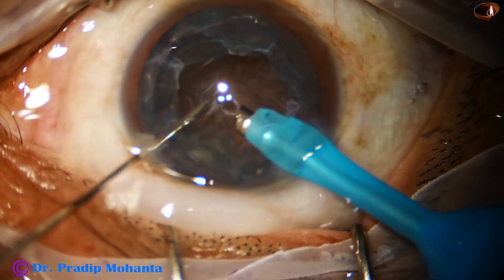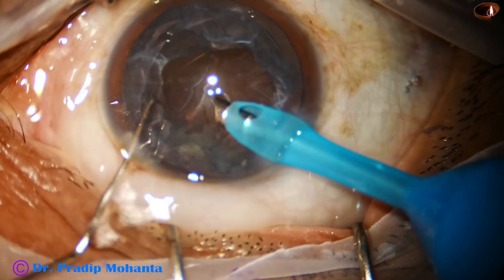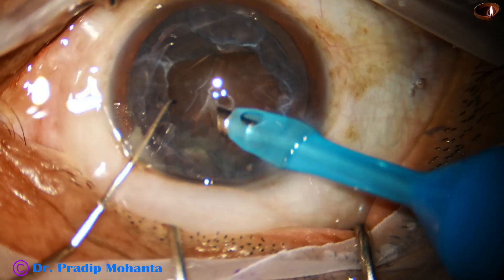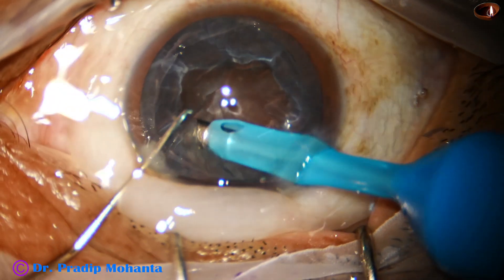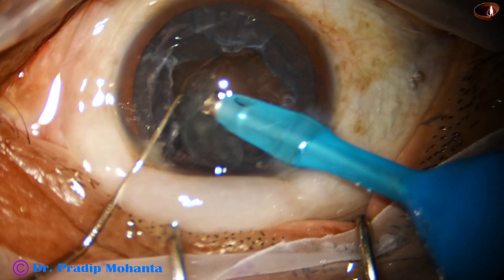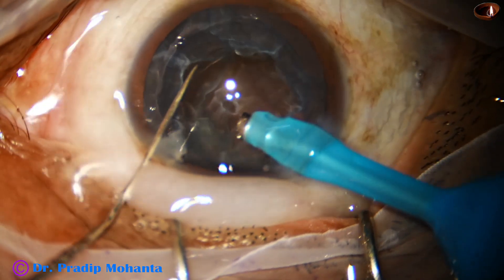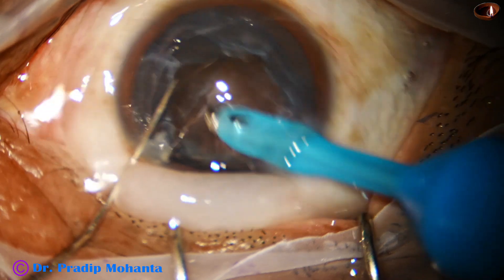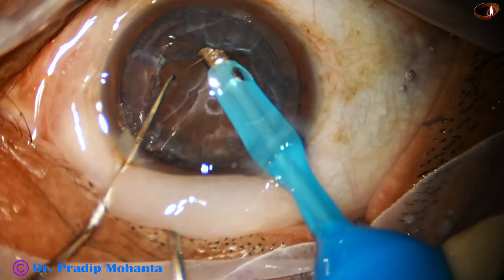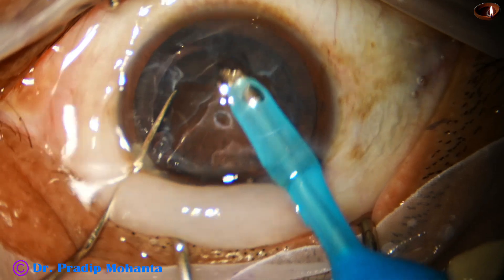Now there is a small hole in the epi-nucleus and she is trying to pull the epi-nucleus and emulsify the epi material. At this time the vacuum is low, that's why the pieces are not coming easily.